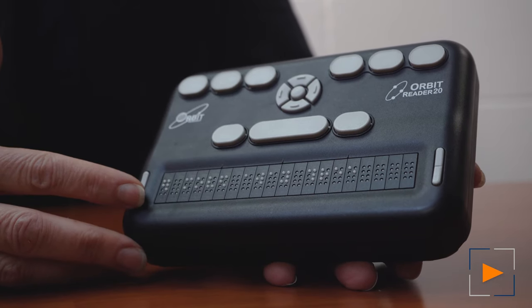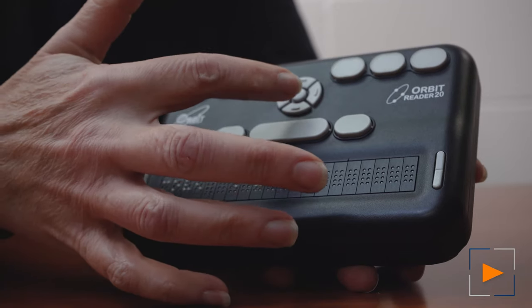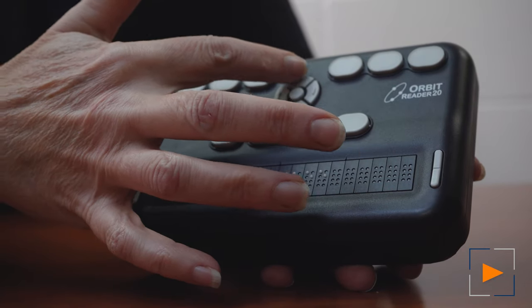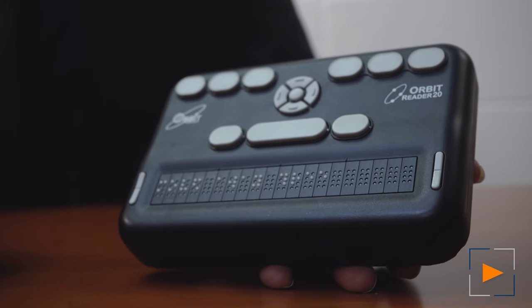The rocker keys will advance the Braille display forward and backward. And then the mouse control button in the center has the up and down, or left and right keys, and also a select or enter option in the center.